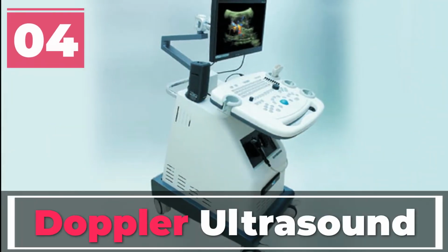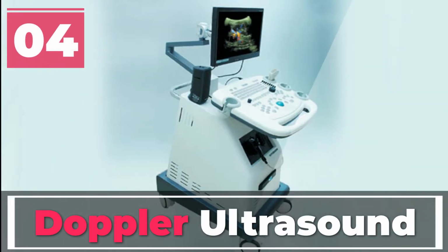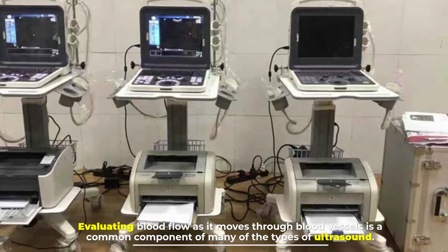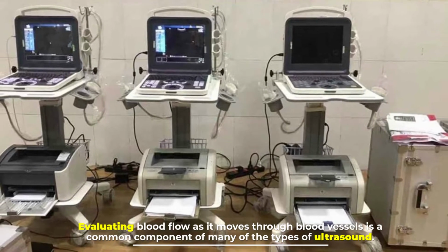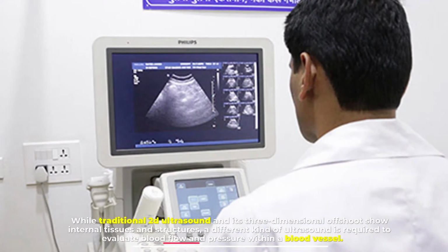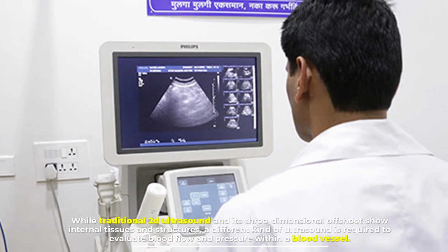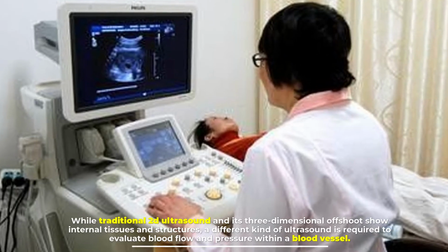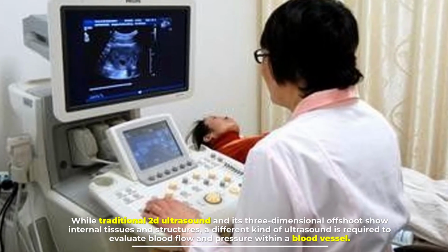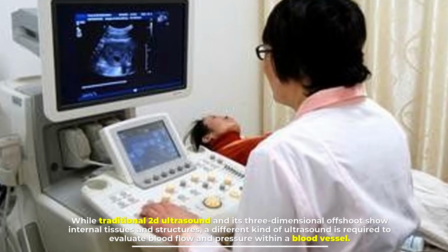Number 4. Doppler ultrasound. Evaluating blood flow as it moves through blood vessels is a common component of many of the types of ultrasound. While traditional 2D ultrasound and its three-dimensional offshoots show internal tissues and structures, a different kind of ultrasound is required to evaluate blood flow and pressure within a blood vessel.